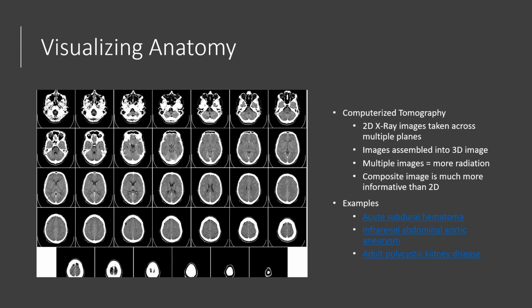And what's great about that is, let me draw that person's head back here again real fast. Here's their head. Okay, if they have a tumor here, and you were to just take an x-ray of their head, let's look at it from a front view, here's their nose, you would see a circle here for the tumor. You don't know, based on that x-ray, if it's in the very front of their head, the very back, or smack in the middle.